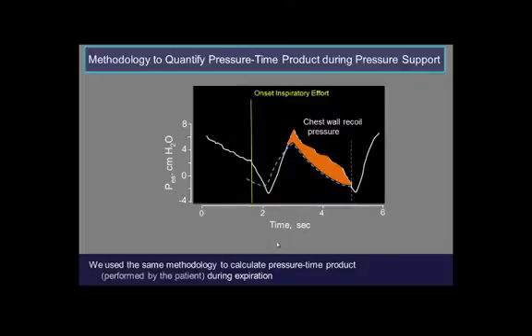Then we use the exact same methodology to calculate the expiratory work. You go through the same process to calculate the work performed during expiration. But to do these calculations for one patient, it took several days. So obviously this is completely impractical for clinical management.